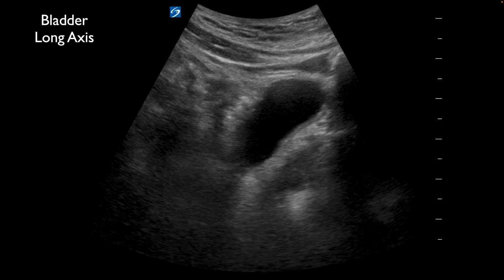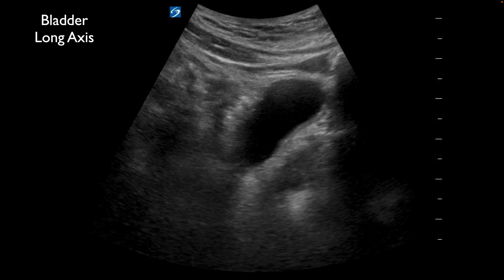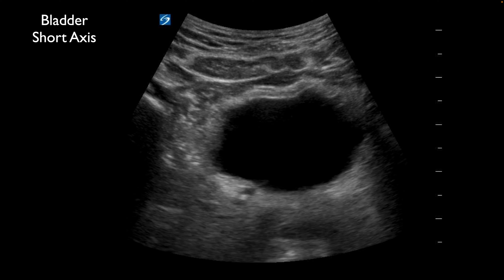Lastly we're going to jump down to the bladder. I like to look for the bladder first in long axis because it's easier to find — we first identify our pubic bone and place the probe just superior to that with the probe marker towards the head. We can appreciate the pubic bone because of shadowing through here, and then evaluate the bladder. Fan right to left through the bladder to evaluate for any findings within the bladder itself, then go to a short axis view with the probe marker to the patient's right. What we see here is the ureter is actually dilated — we see that anechoic area and then a bright hyperechoic structure within it — that is a ureterolithiasis.